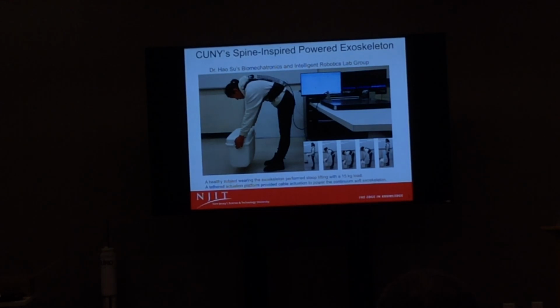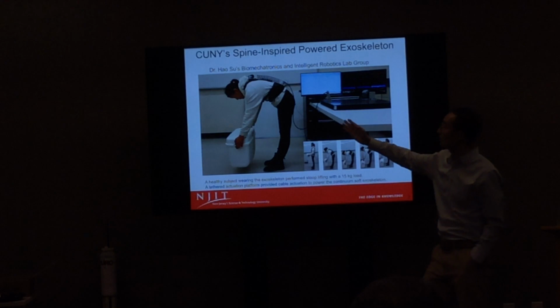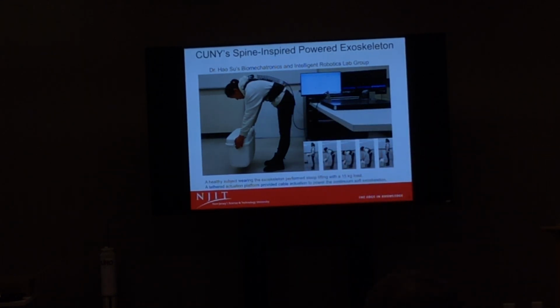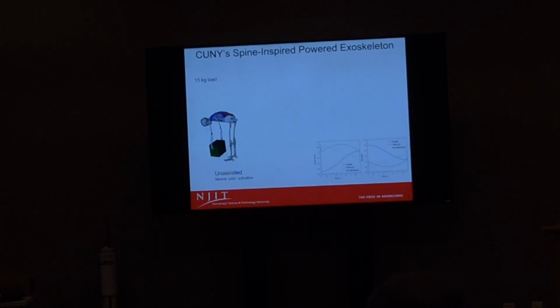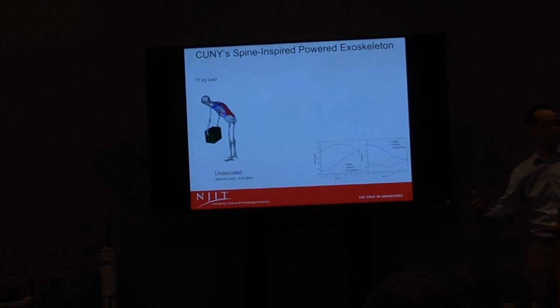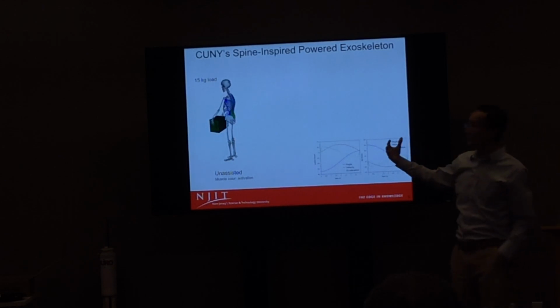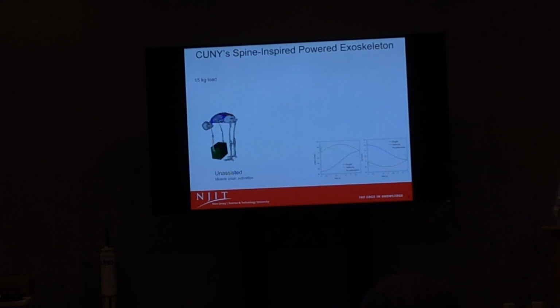Okay, so one of the things from maybe the last two weeks, we talked about how we have a normal spine-inspired device, which can generate the lifting force perpendicular to the torso, which is quite innovative as I can see. But the thing is, you want to discover how much that affects your musculoskeletal loading. So in the modeling part, I'm trying to model a simulation. Say when you lift a weight, like 15 kilograms, how much muscle actuation, how much muscle force on your spine?